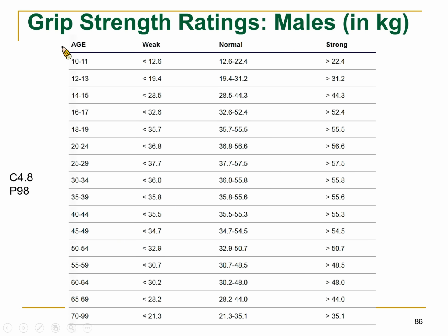So you can see how to use this chart. You can see from the age here, and if you are 31, then the normal range of your grasping power is 36 to 55 in kilograms.